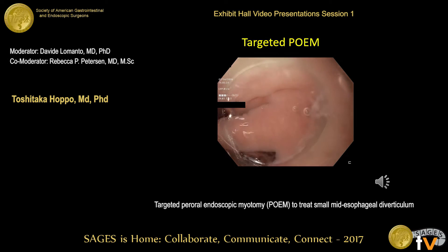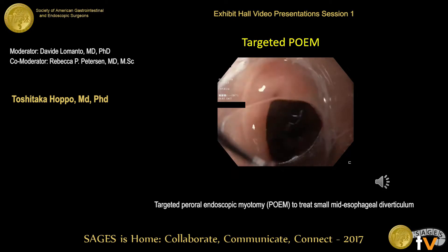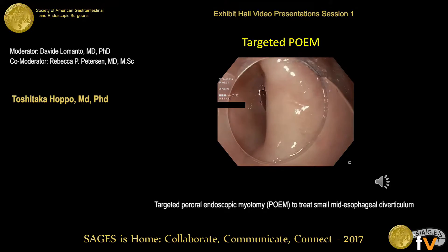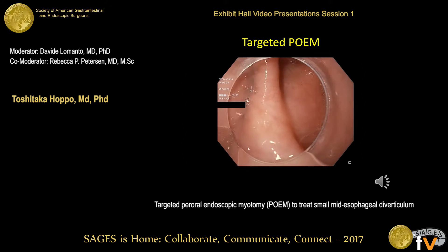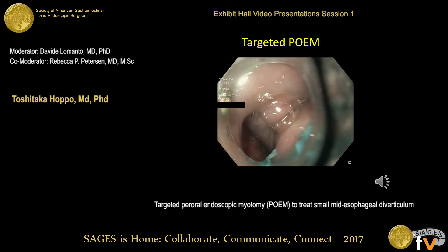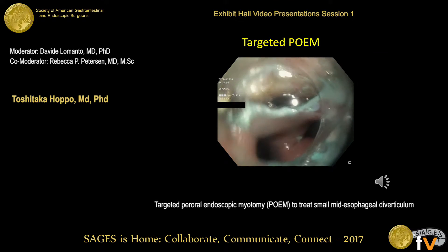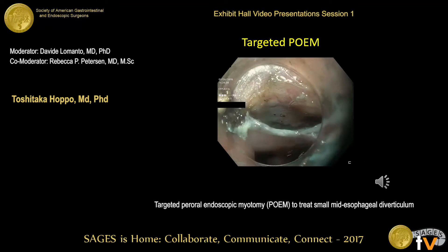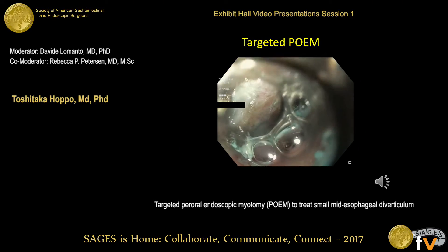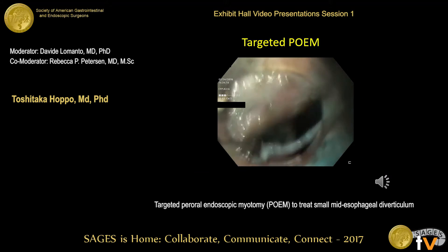We decided to perform the POEM procedure to divide this muscle band. In this video of the procedure, you can see the true lumen here — I felt the popping sensation when I passed the scope. There is a very thick muscle band and a small diverticulum here. I created a 1.5-centimeter mucosal entry two centimeters proximal to the muscle band, and created a 4-centimeter submucosal tunnel.